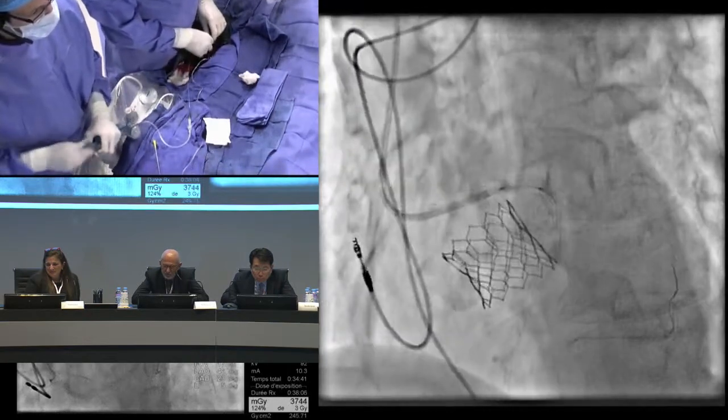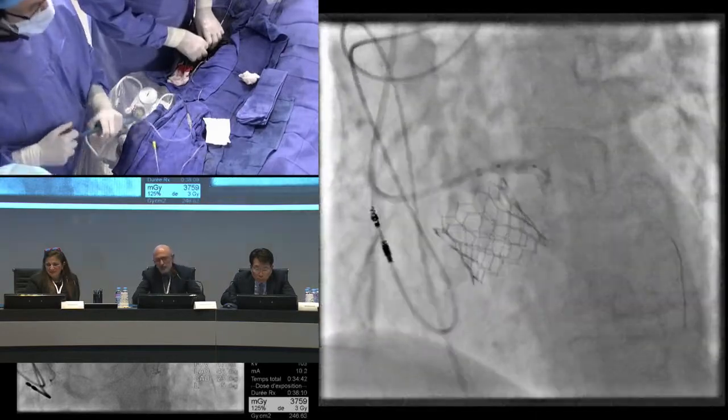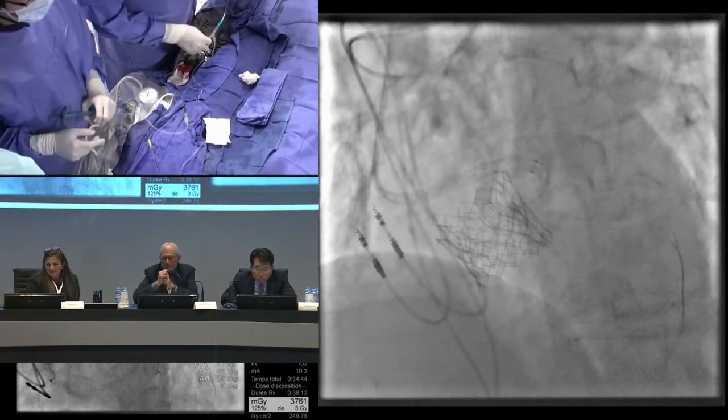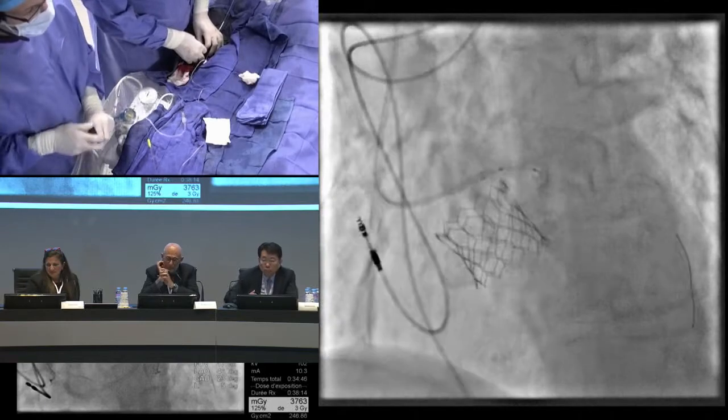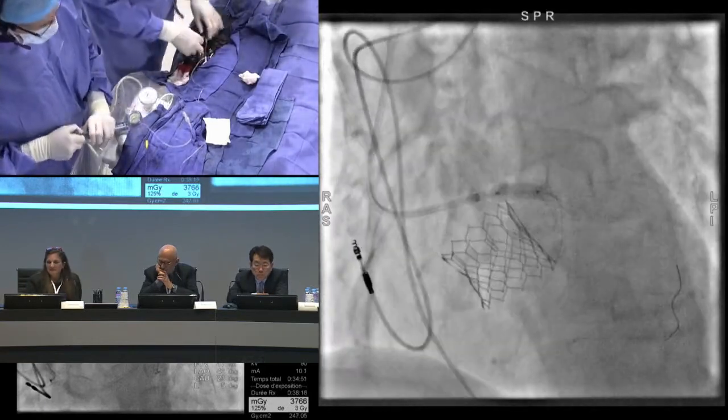Go. 14. Stop. Press. Rupture? No, don't inject. Okay. Pierre had injected. Okay, go on here. No rupture? No rupture. Okay, perfect. It was the injection of the contrast.